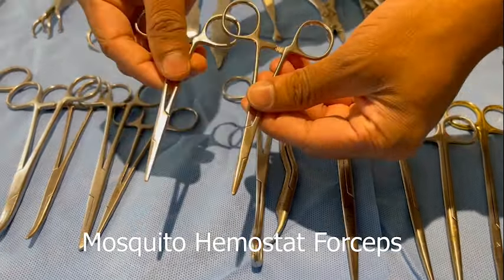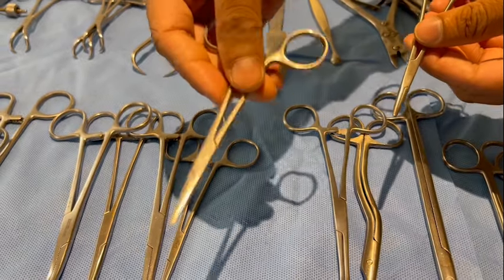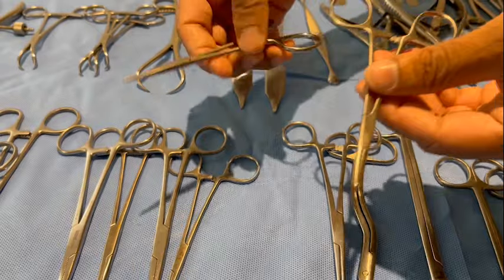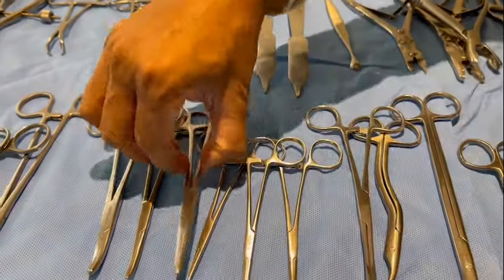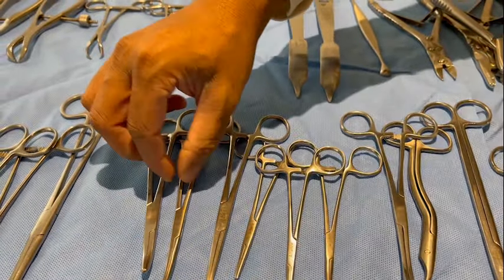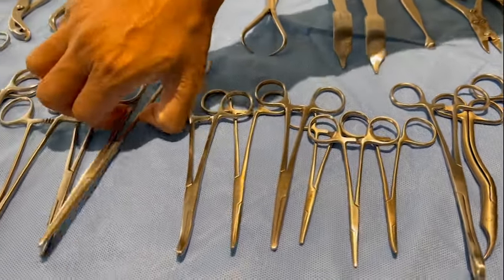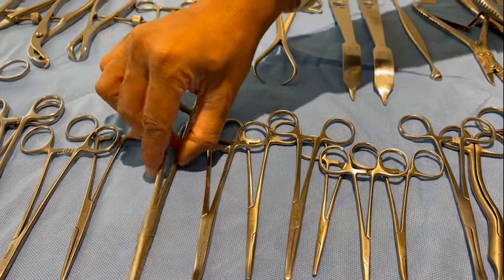These are mosquito forceps or small hemostats — this is a straight small hemostat and this is a curved mosquito, or curved small hemostat. This is a long artery forceps or hemostat forceps — this is straight and this is curved. This is also a curved artery forceps, and this is a long straight artery forceps.